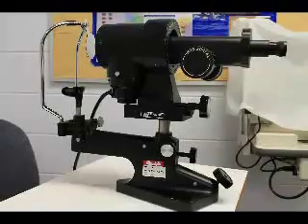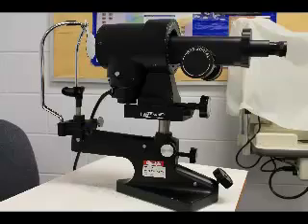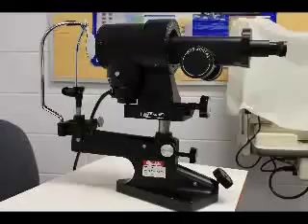One, to identify the amount and type of corneal astigmatism, and two, to identify the proper base curve of the contact lens being fit to the patient's eye.